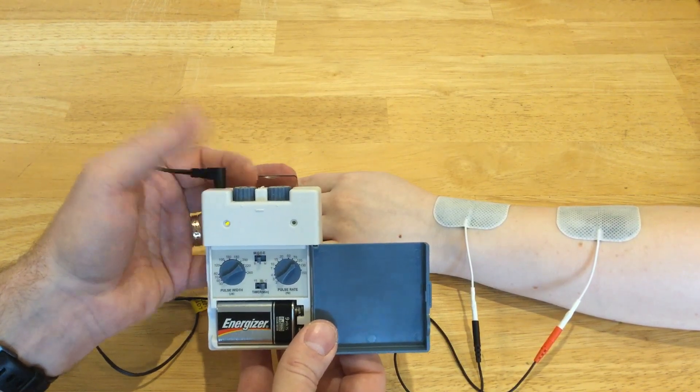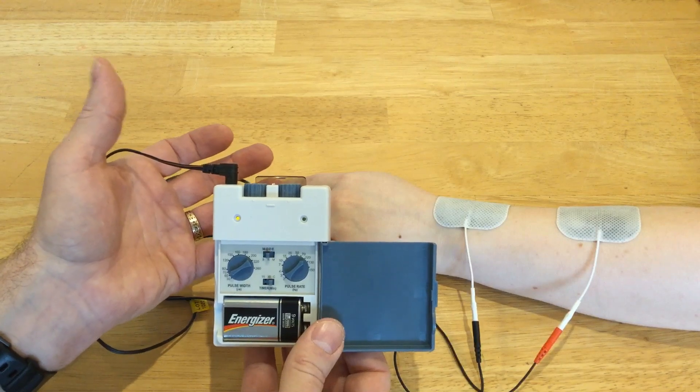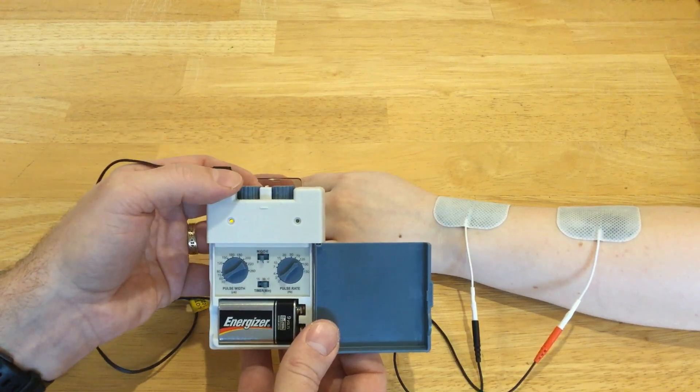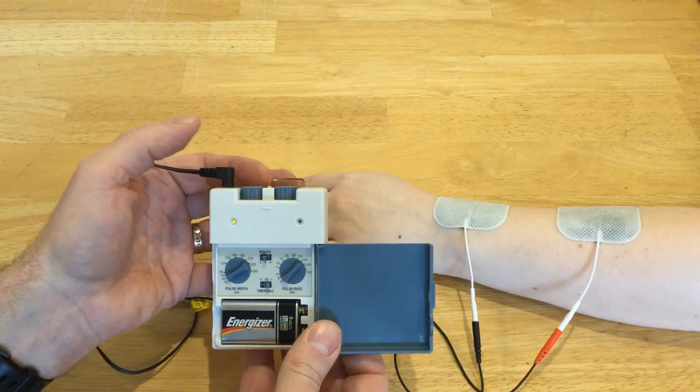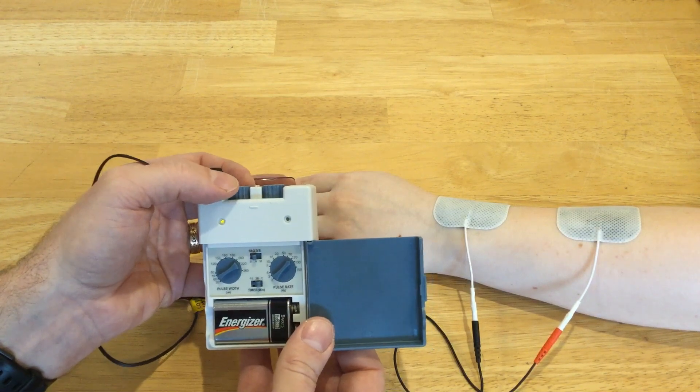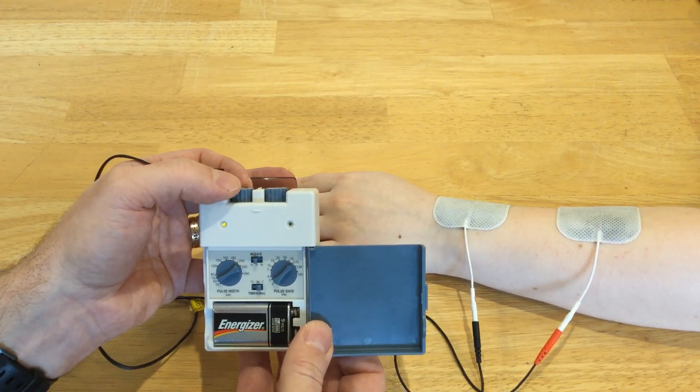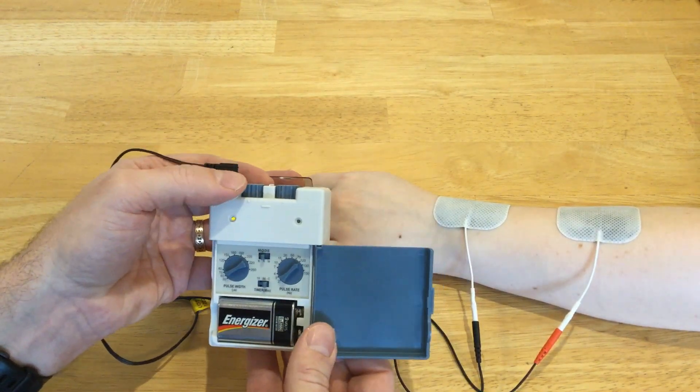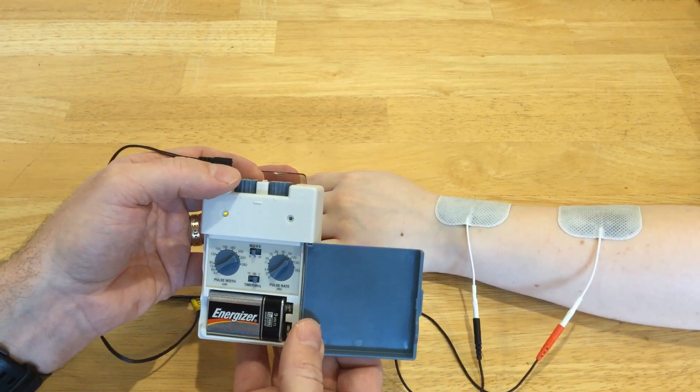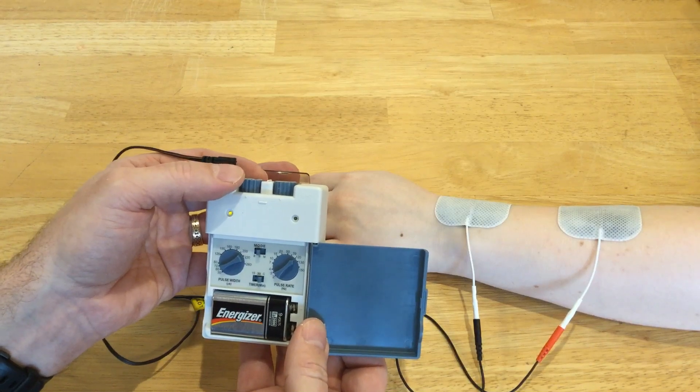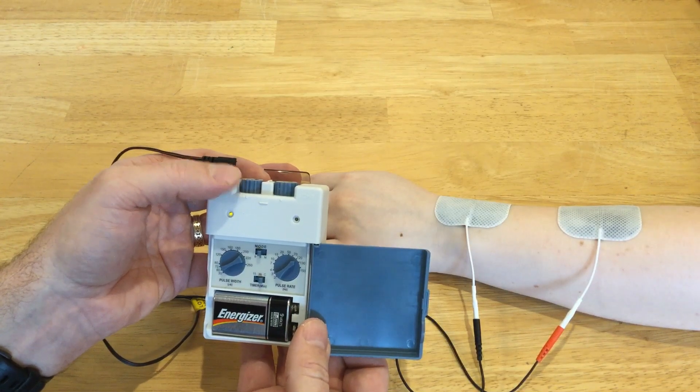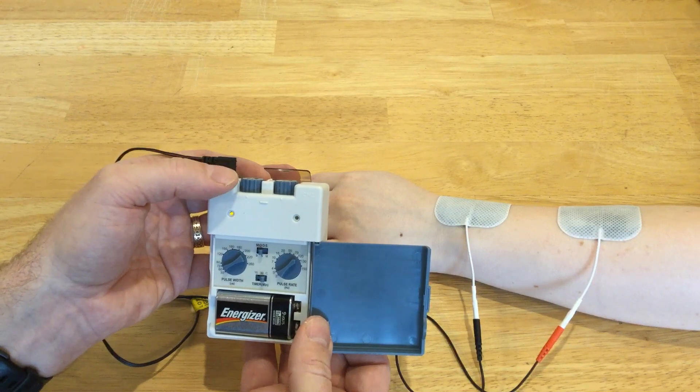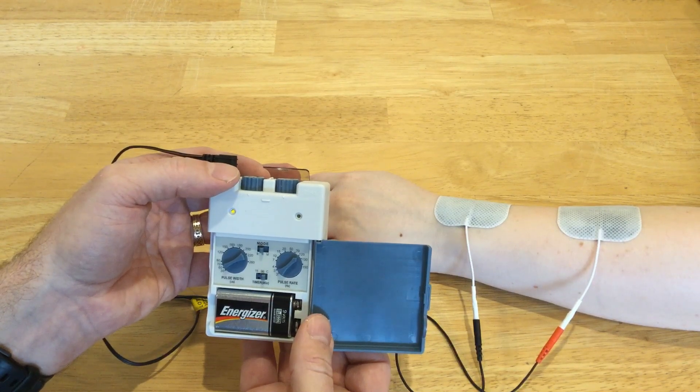And that's basically conventional TENS. You could leave this on as long as you wanted, up to really 24 hours a day. And the conventional TENS will close the gate on the pain signals. Conventional TENS also seems to do some endorphin release as well, but primarily we think of it as closing the gate.